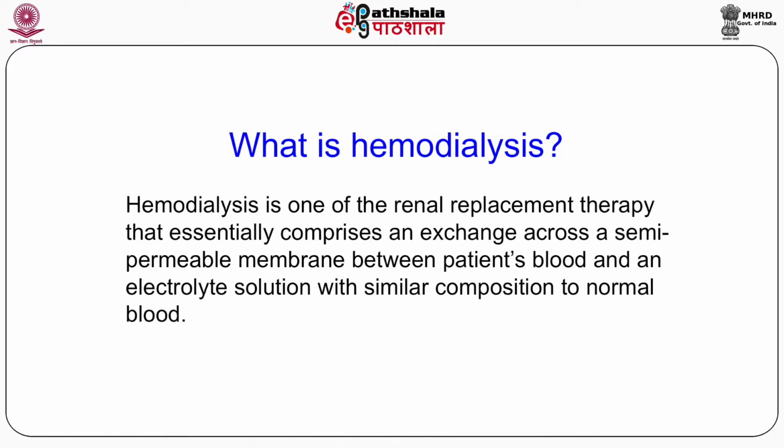Hemodialysis basically involves a process of exchange of waste products and electrolytes across a semi-permeable membrane between the patient's blood and an artificial electrolyte solution which is synthesized with a composition similar to normal extracellular fluid.